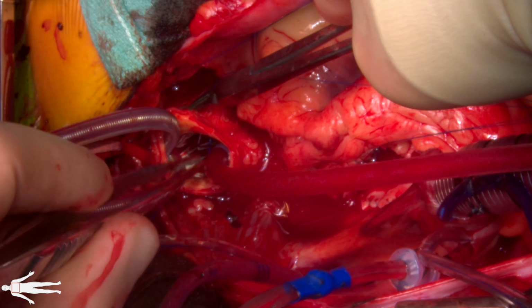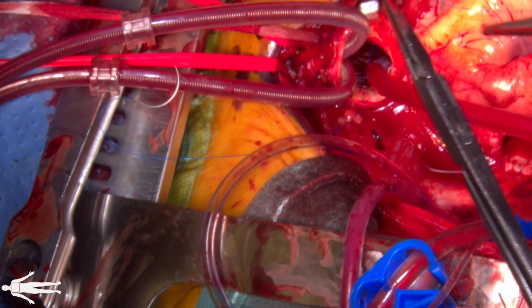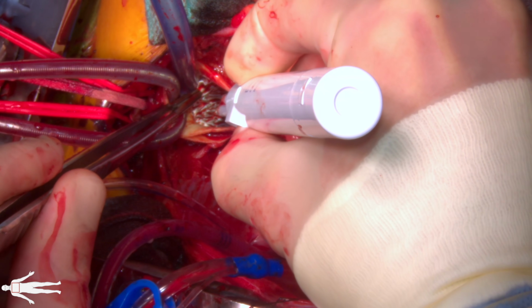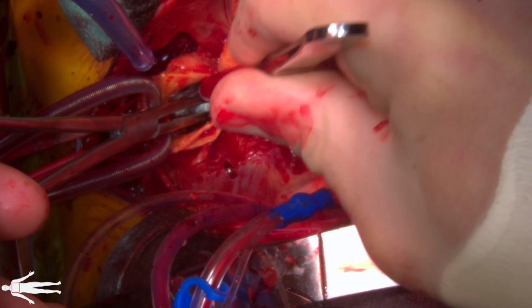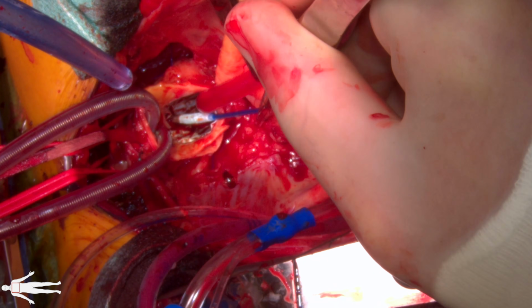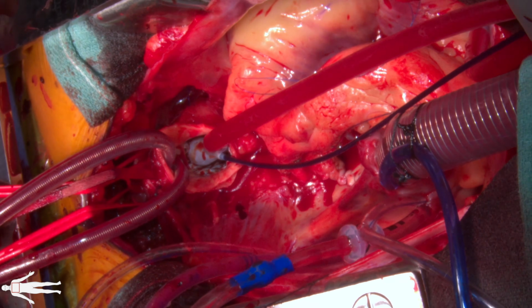The graft was then secured along the greater curvature of the arch with 2 interrupted 4-0 Prolene sutures. A fenestration was then made in the graft at the ostium of the left subclavian artery using an ophthalmic cautery. An 11 by 29 millimeter VIABAHN balloon expandable stent was then deployed through the fenestration into the left subclavian artery.